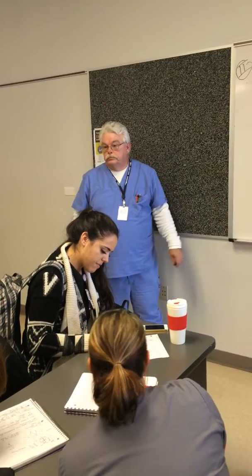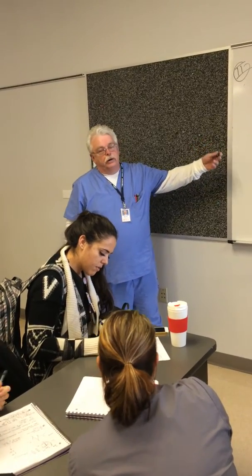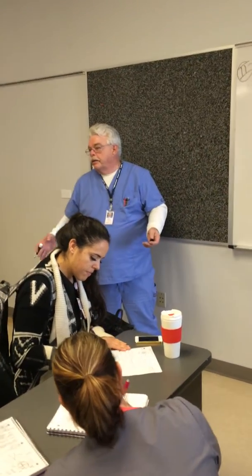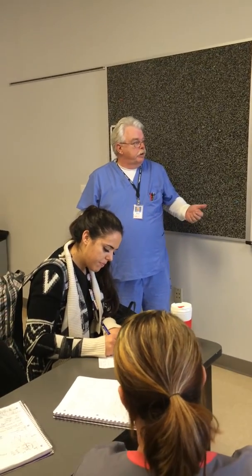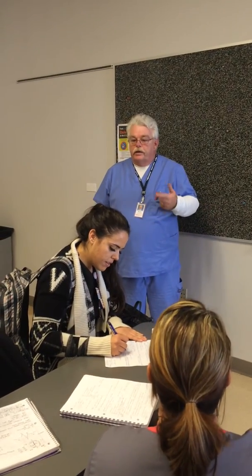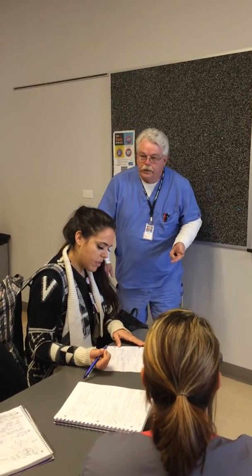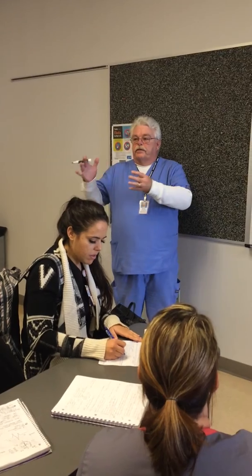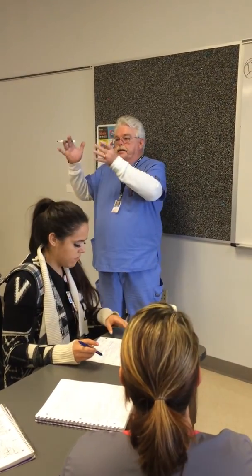PR. What's it be? Right, there's all kinds of other weird stuff, like if the PR interval is less than 12, what's that? And the other one they talked about in the book that you don't see very often is a sinus arrhythmia. Sinus arrhythmia is your heart rate speeds up when you inhale and it slows down when you exhale. So you'll see all this stuff. It's not necessarily regular. You see PQRST, PQRST. You'll see blocks of regularity.